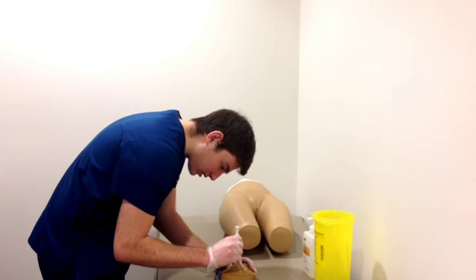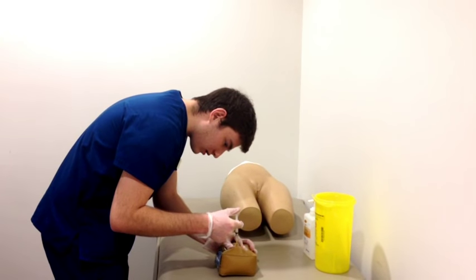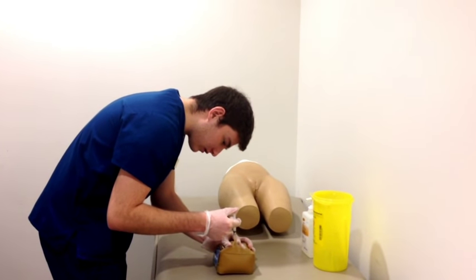So I'm going to quickly inject it in. And release over several seconds.